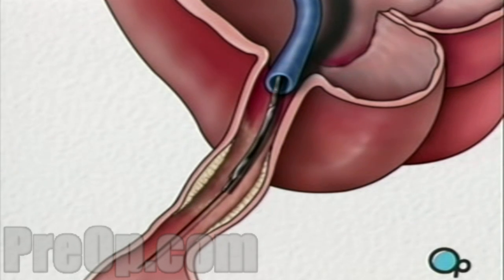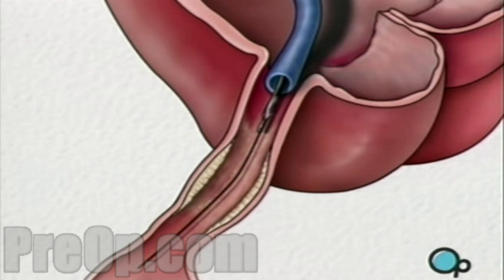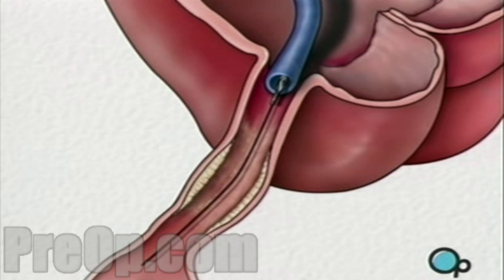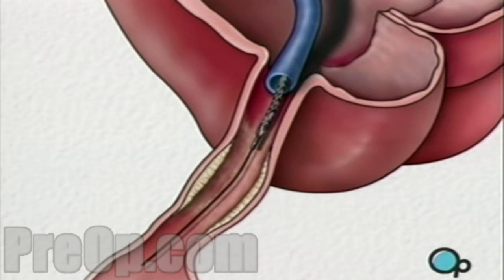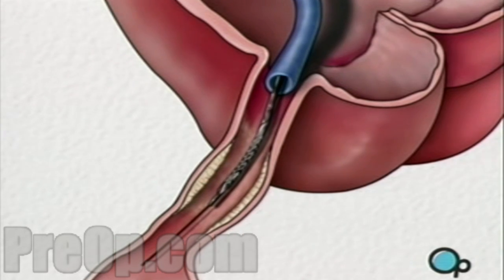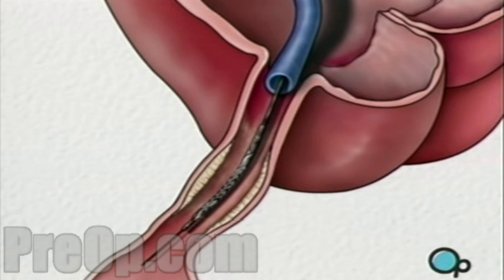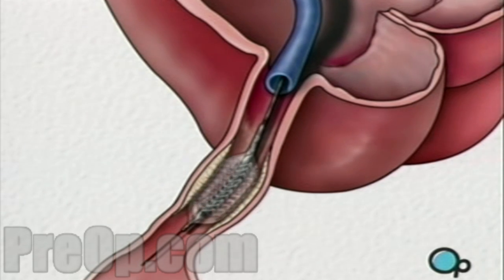The balloon catheter is then withdrawn and another balloon catheter is inserted. This balloon has the mesh stent tube wrapped around it. Once this tube has been placed in the center of the now-widened area of the artery, the balloon is briefly inflated. The stent expands until it hugs the walls of the artery.